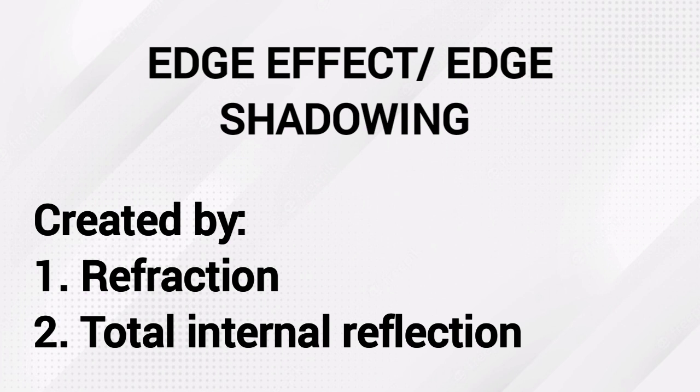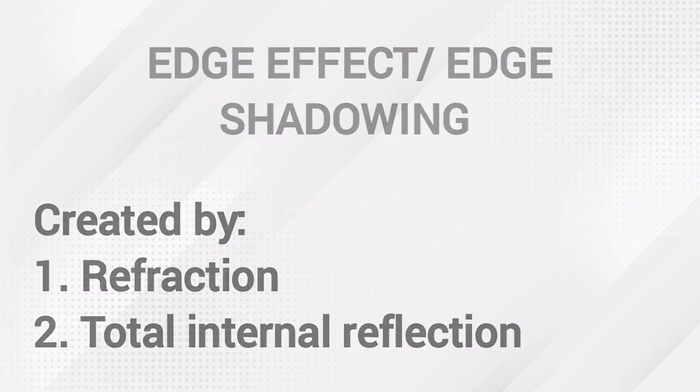So reflection back towards the sound beam in the direction it came will not be possible. Since sound energy is lost along the central beam axis, a shadow is produced along the central beam axis at the edge of the gallbladder. This is the reason why you see those dark shadows. They are not because of bone or calcification, but usually because of refraction.